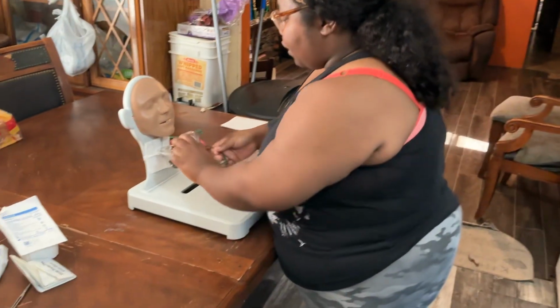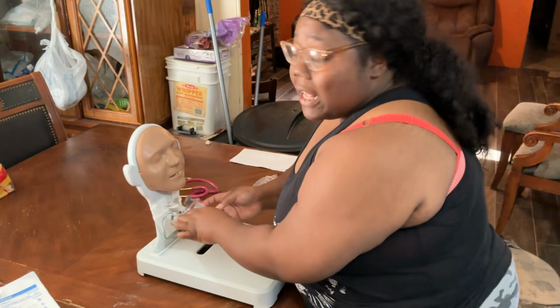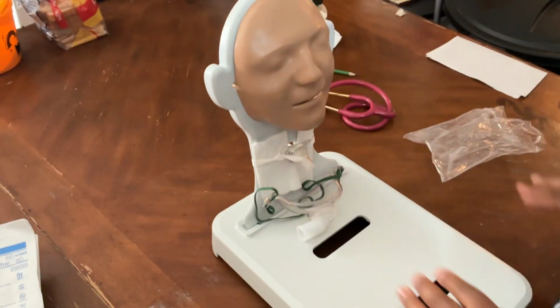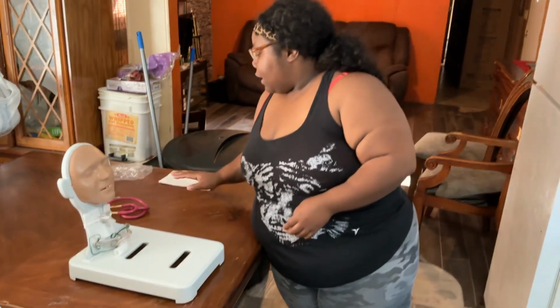Okay, and another thing with this, the way this head is made, this oxygen thing does not stay on, but in the real world, you know it would be there. So we're going to lay it right there. I already performed hand hygiene, so I'm going to go ahead and get things ready, and let me verbalize this. This will be my sterile solution. I did not receive a sterile water in my lab bag, nor did I get one in my kit that I received. So this is going to be my sterile solution. In the real world, we know that this would not be my sterile solution, but for these purposes, this is my sterile solution. It is within date. I've checked the date on it.